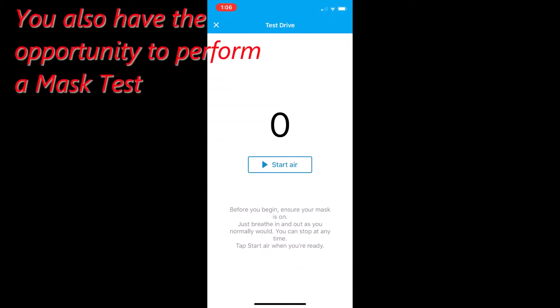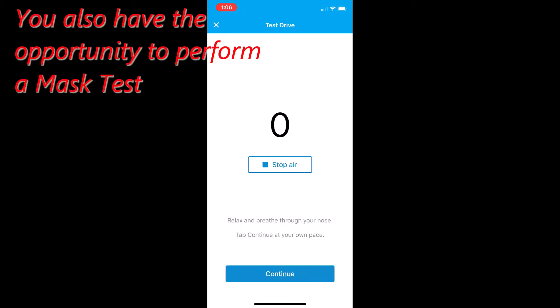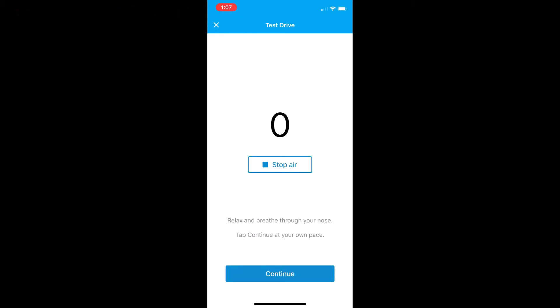Before you begin, ensure your mask is on, relax, and breathe through your nose. Tap continue at your own pace.